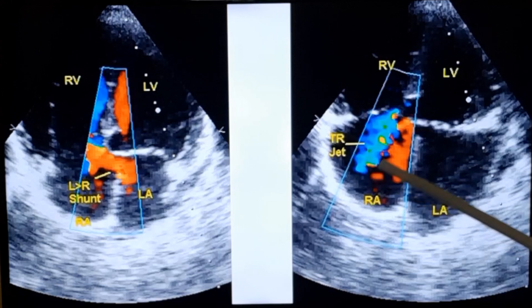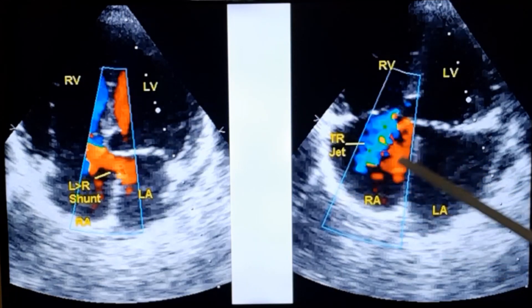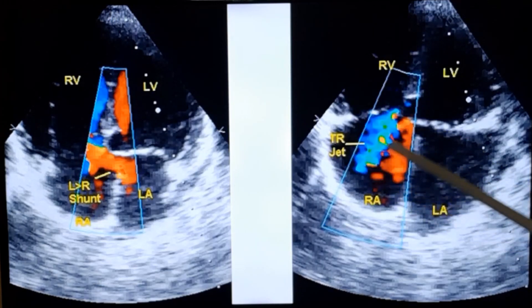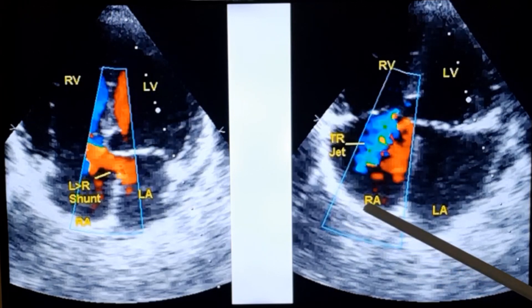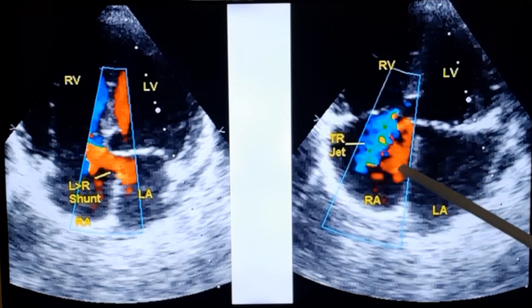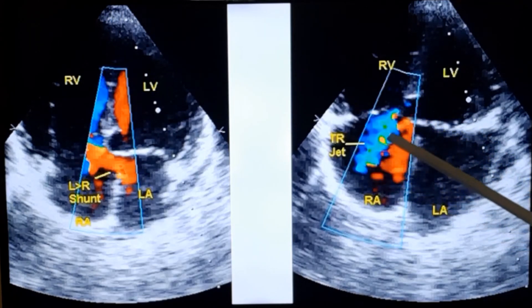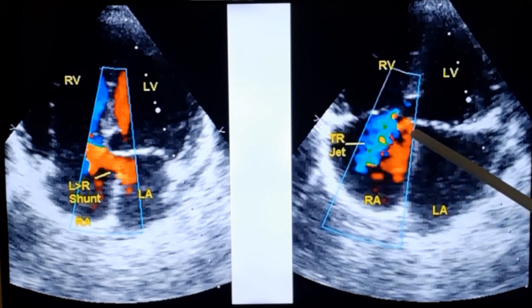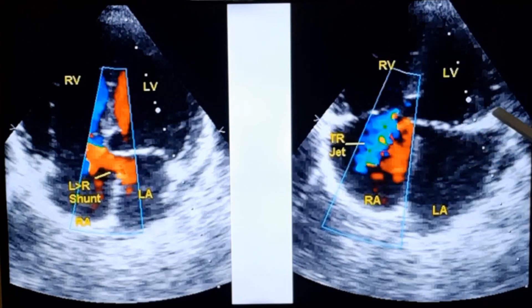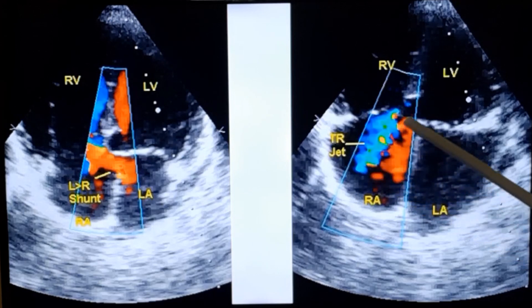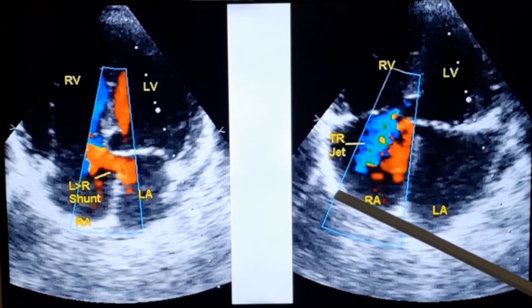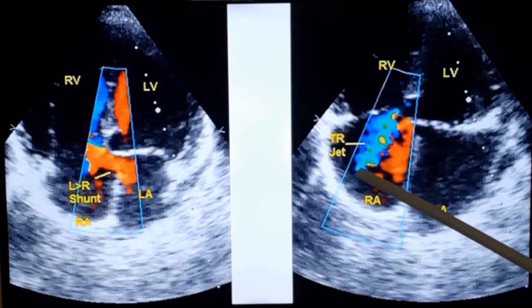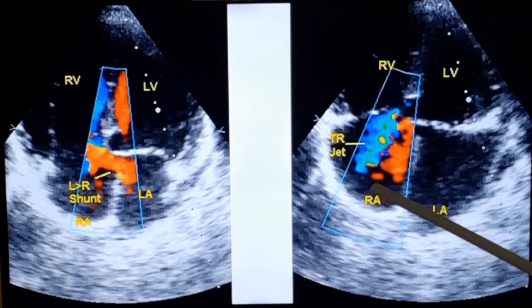If there is pulmonary hypertension, the velocity will be higher, which can be assessed by spectral Doppler — not color Doppler. The spectral Doppler display shows the velocity of the jet, from which you can estimate right ventricular systolic pressure and indirectly the pulmonary arterial pressure. In this case we cannot be certain whether the TR is due to a cleft in the tricuspid leaflet or pulmonary hypertension. In primum ASD it can also be due to a structural defect in the tricuspid valve, though more classical is mitral regurgitation due to cleft anterior mitral leaflet. TR can also occur without pulmonary hypertension or structural valve defect; even in normal individuals, mild tricuspid regurgitation can be present without much significance.